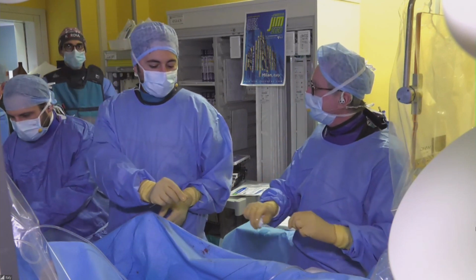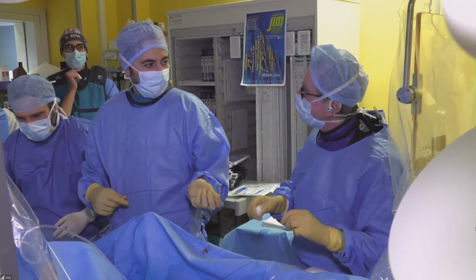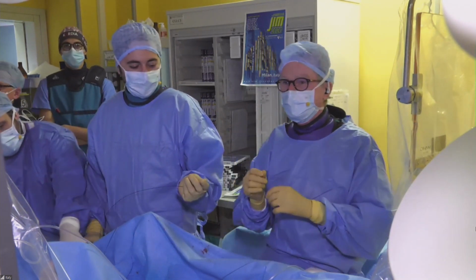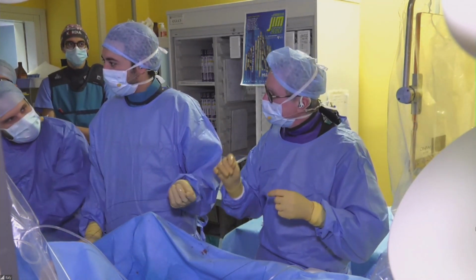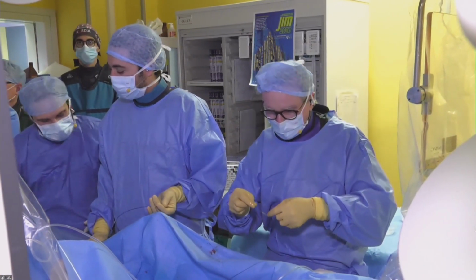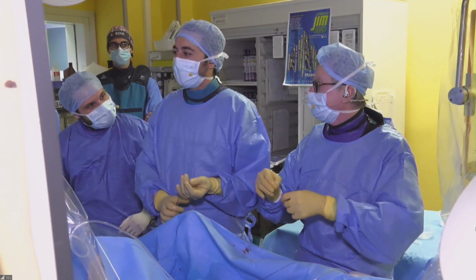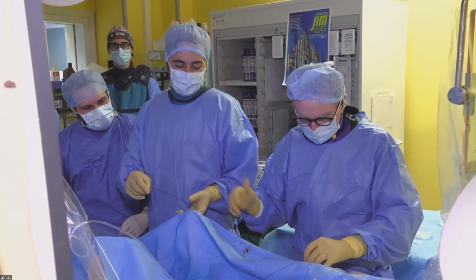Every time you do something, you have to ask yourself why you're doing it. So we do the IVUS in order to check if we need to predilate. Okay. I like this approach. Not just do something for the sake of doing it.